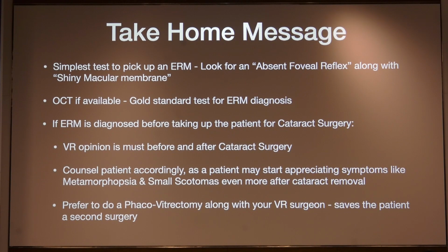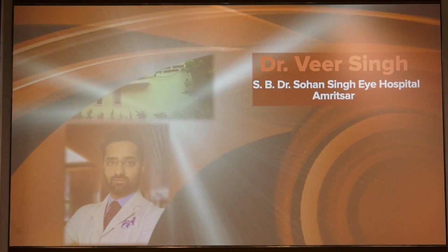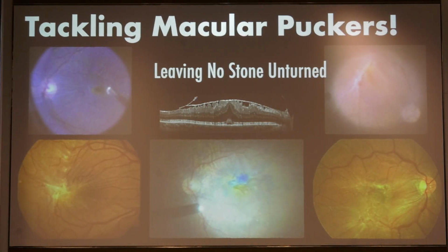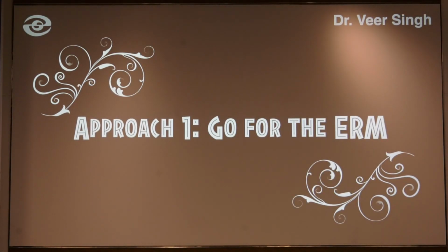If ERM is diagnosed before taking up the patient for a cataract surgery, a VR opinion is a must before and even after cataract surgery. Counsel the patients accordingly, as the patient might start appreciating macular symptoms like metamorphopsia and scotomas even more after cataract surgery. Prefer to do a phaco-vitrectomy along with a VR surgeon, which saves the patient a second surgery. Last but not least, this is just a 1-minute video showing a couple of cases in which different approaches have been applied to take care of an epiretinal membrane.